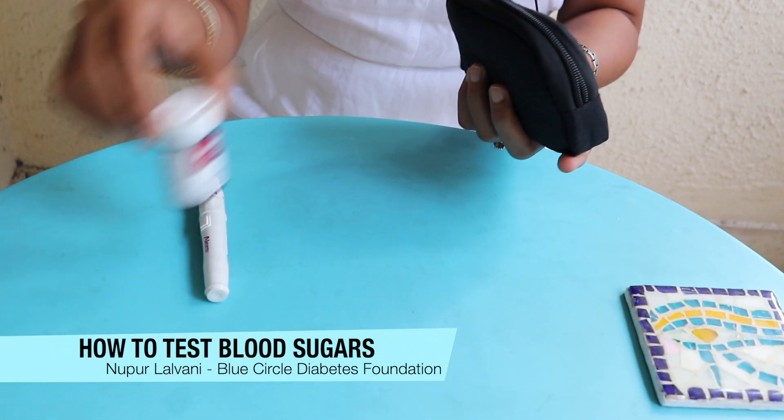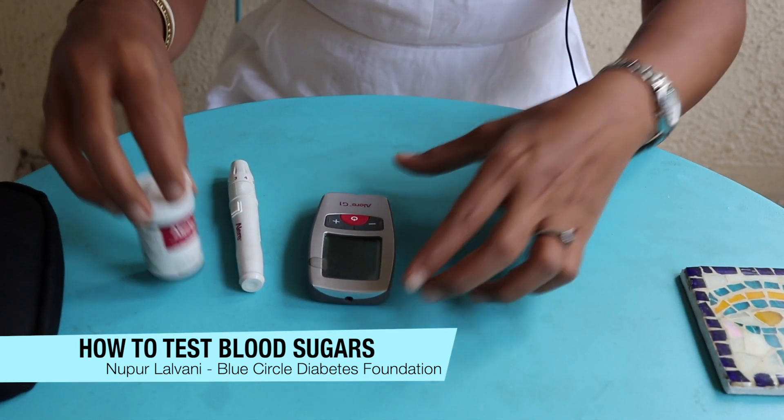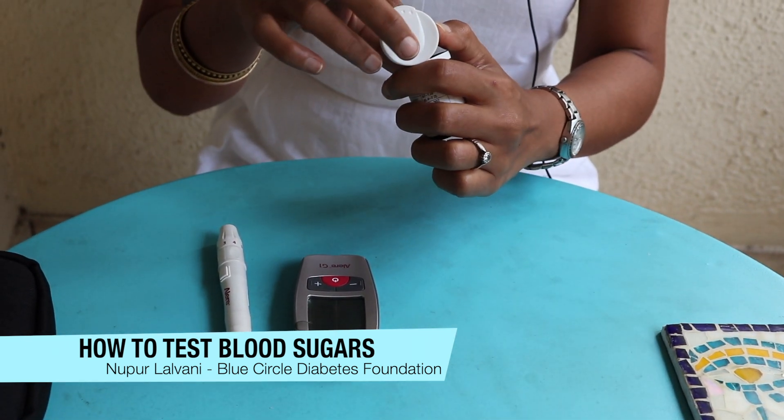That's my lancing device, these are the test strips, and here's my glucometer. Now whichever company you may use, you'll find these things in common.